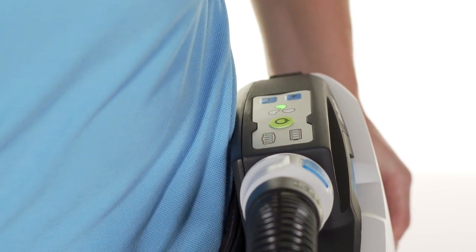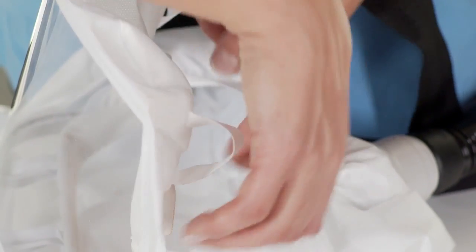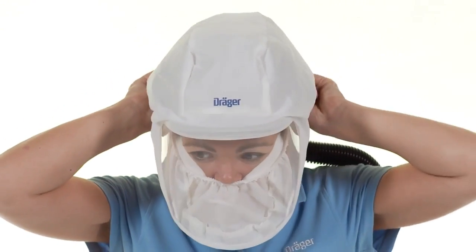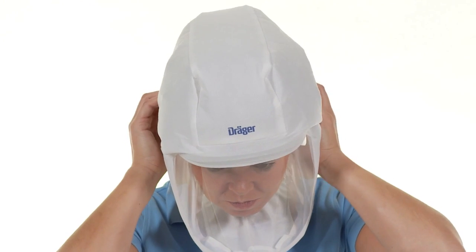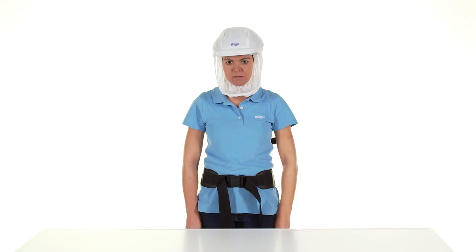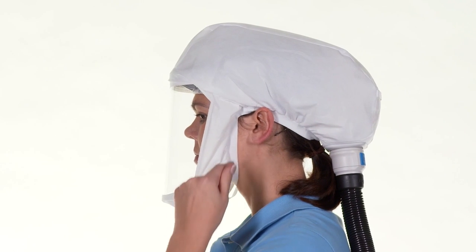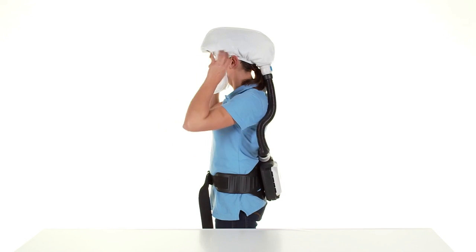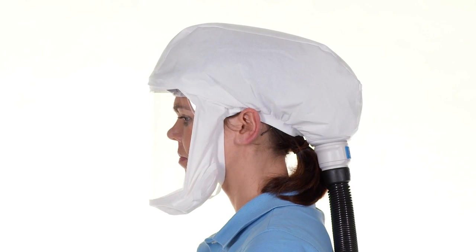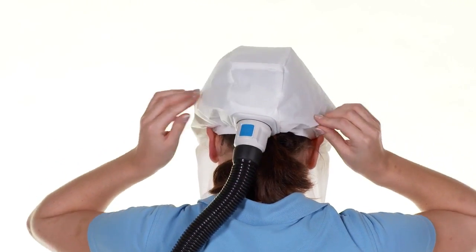Caution: do not put on the hood until the unit is switched on and the air supply is thus ensured. Now put the hood on using the fitting loops. The hood rests on the forehead and runs around the head. The face seal runs under the chin, above the ears and along the back of the head. Make sure that the support ring is located completely within the sealing area. Check the fit of the hood — it must fit closely with a good seal, securely and comfortably. To increase comfort, you can make subsequent adjustments with the quick adjustment system. The system is now ready for use.